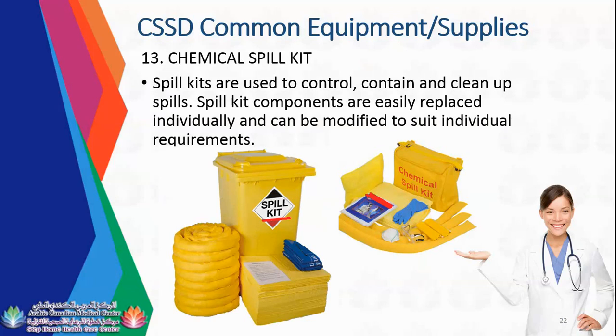Chemical spill kit, actually it is mandated and mandatory to have a chemical spill kit in CSSD because you are using chemicals in CSSD. There are three commonly used chemicals in CSSD. Your enzymatic cleaner or enzymatic detergent, where these chemicals are used in the enzymatic ultrasonic machine. The second chemical is instrument disinfectant. The third chemical is surface disinfectant. Surface disinfectant is the disinfectant chemical used to clean your surfaces or working areas.